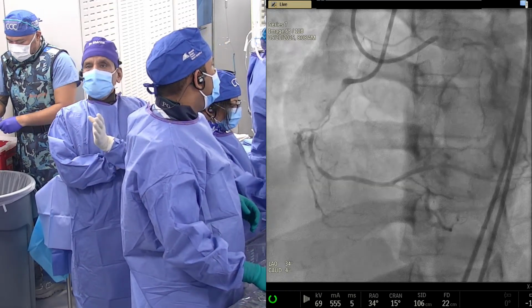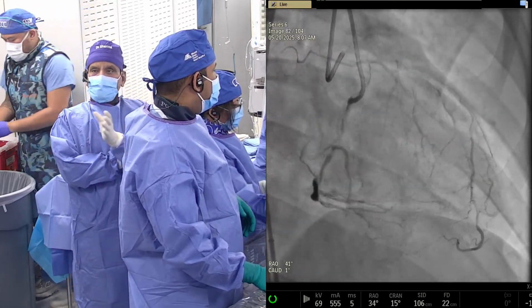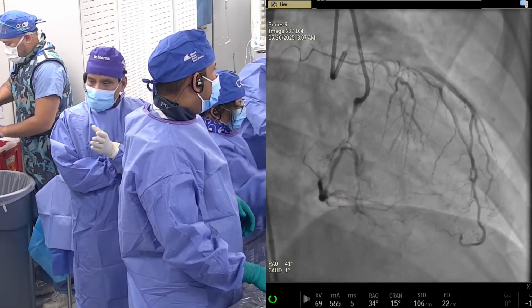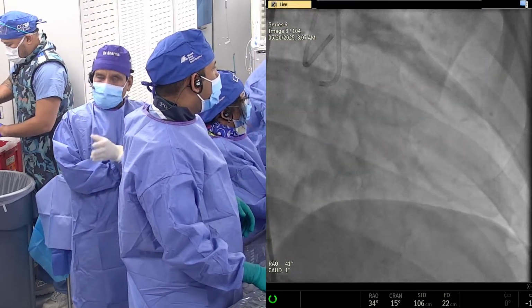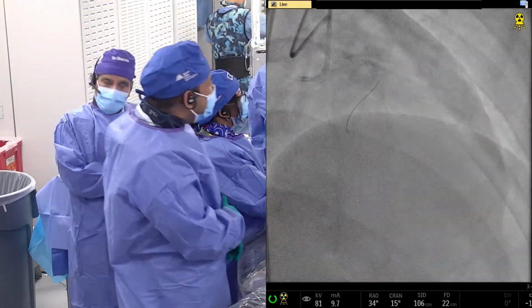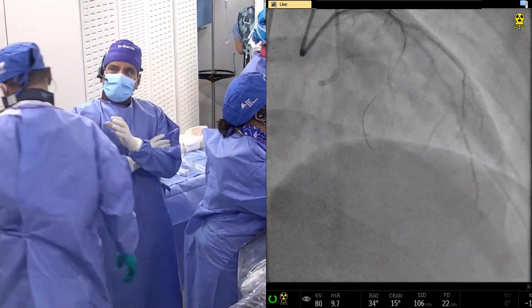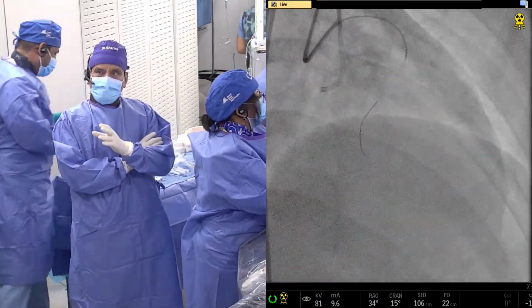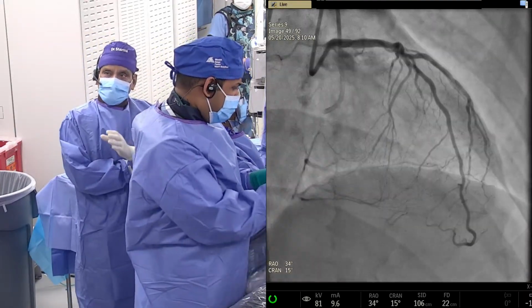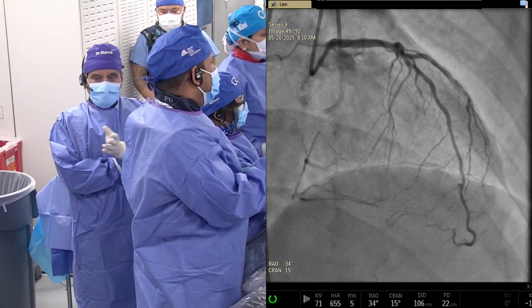The case yesterday came to me with moderate calcium in the LAD, and my associate started doing the PTCA. I said, listen, there is no contraindication in this case to do a rotational atherectomy. The patient has been sent for calcific management, so it will not be good for us not to do rotational atherectomy. You want to do the IVL, that may be okay. It was not a tram-track severe calcium, but it was moderate to severe, so we changed it. Coming back to the point, it is very important, particularly if a senior cardiologist, and more so an interventionalist, has sent you a case. If you do not follow it, that is the end of your subsequent referrals.